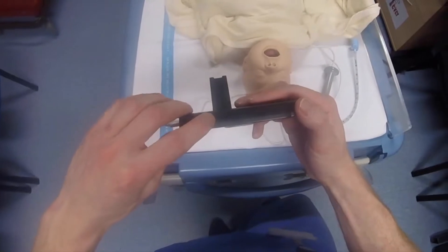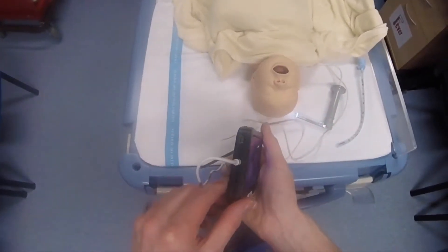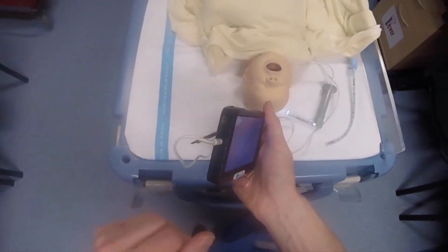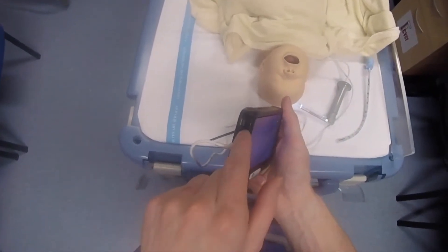It's just this button here to stop recording, and then it automatically saves the video for you. You can get the videos out of the device either by taking the SD card out or using the data cable, which also charges the device through this port. There's also an option to output to a larger display using this port here.